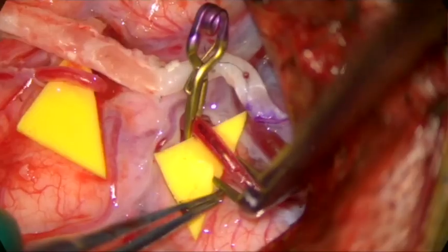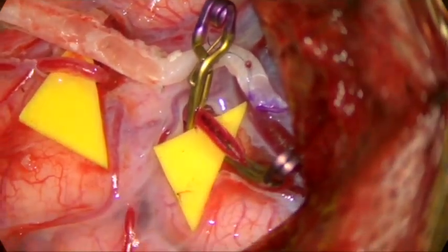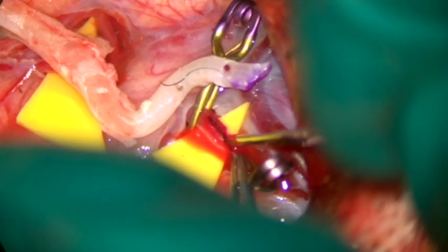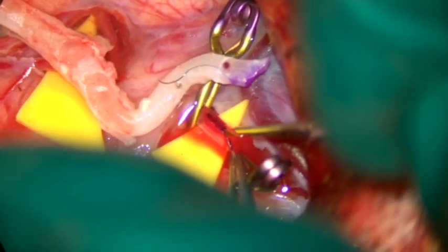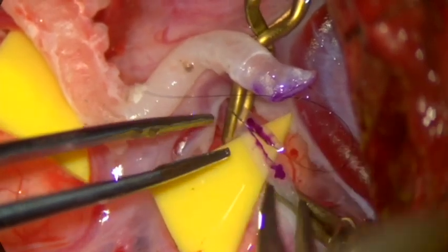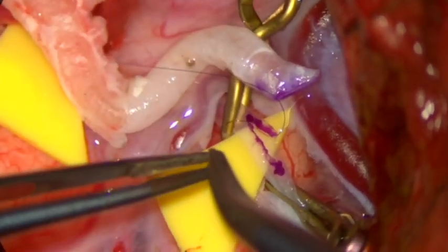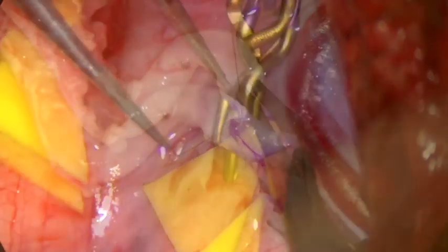I place temporary clips, in this case on the frontal M4 first. I fish mouth the end of the STA. I make the arteriotomy with a beaver blade, and I then anchor the heel of the STA to the 12 o'clock position of the recipient artery.